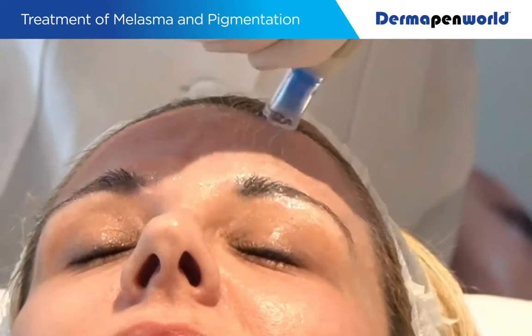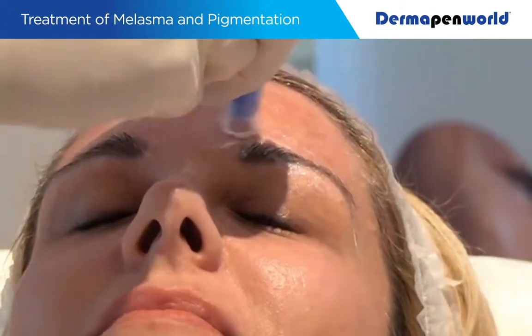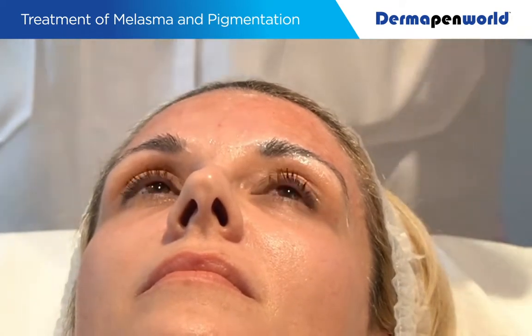Let's keep going. So vertical, vertical, vertical. Horizontal. Diagonal 1. Diagonal 2. You want to hold the device not so tight that you're dragging it through the skin. Keep it light as if you're holding chopsticks. Likewise, also work nice and quick. I work so fast that it looks as if I'm doing this. It's just one stripe, so it's not a multi-stripe.